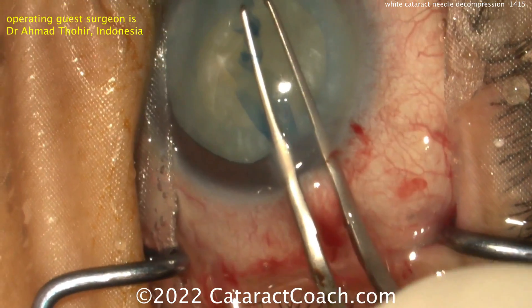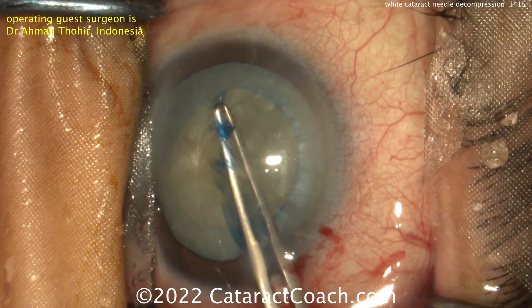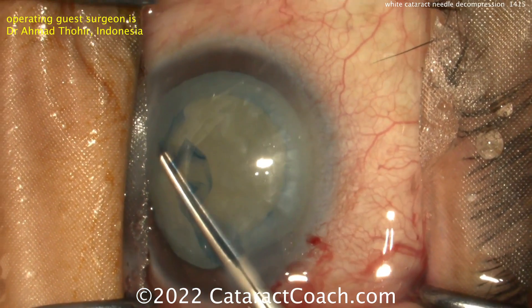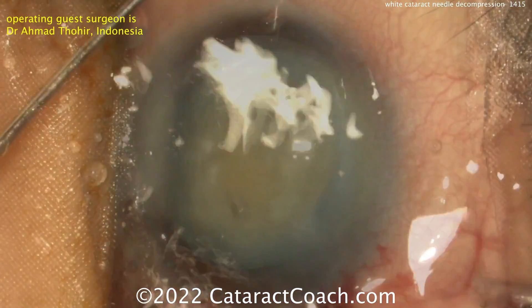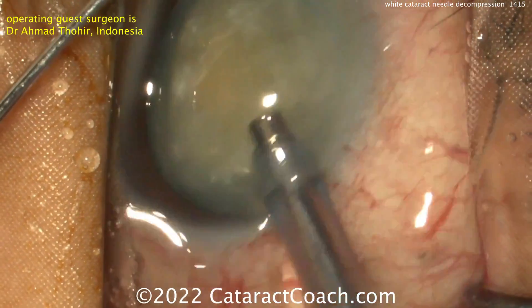Beautiful rexis — very nicely done. And now the rest of the case should be relatively routine. The high-risk part of this case was getting the capsulorrhexis done. More dispersive viscoelastic is a good idea.